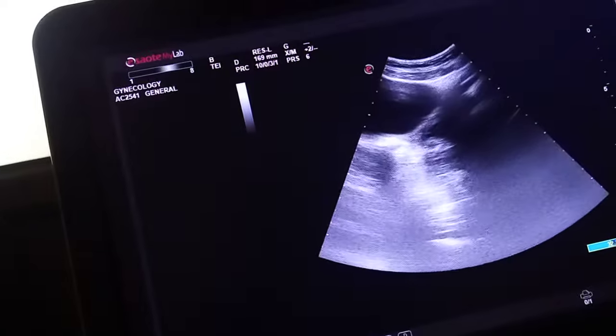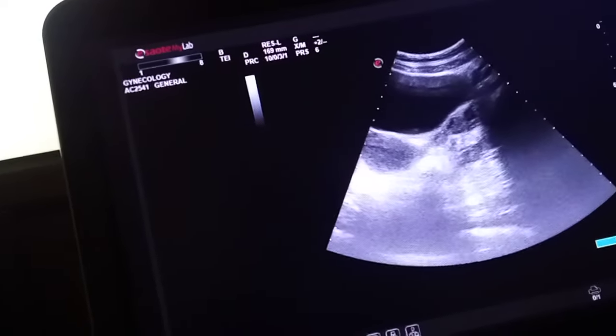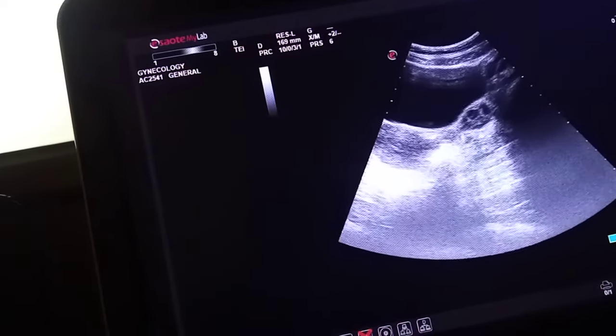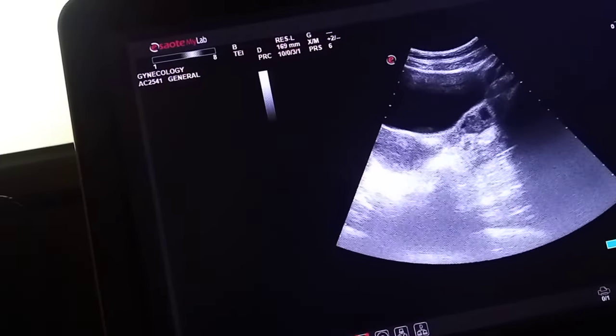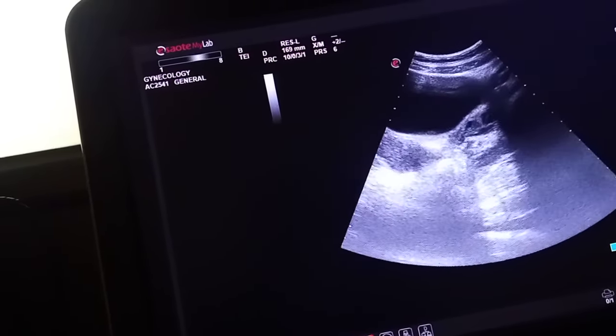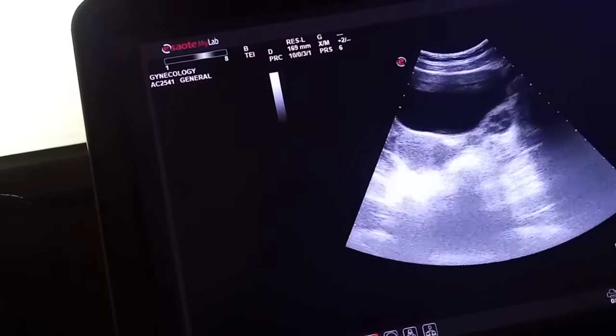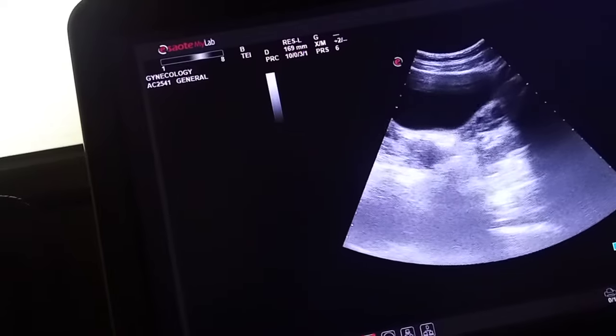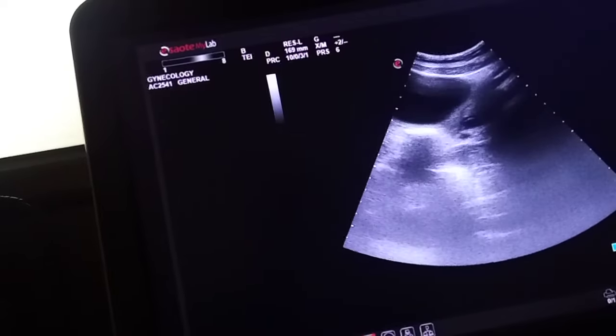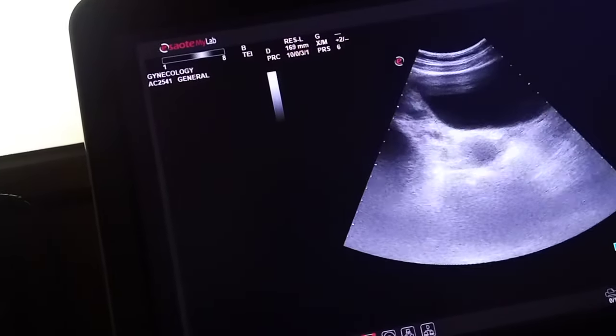And this is the other adnexa that shows some small follicles inside it.